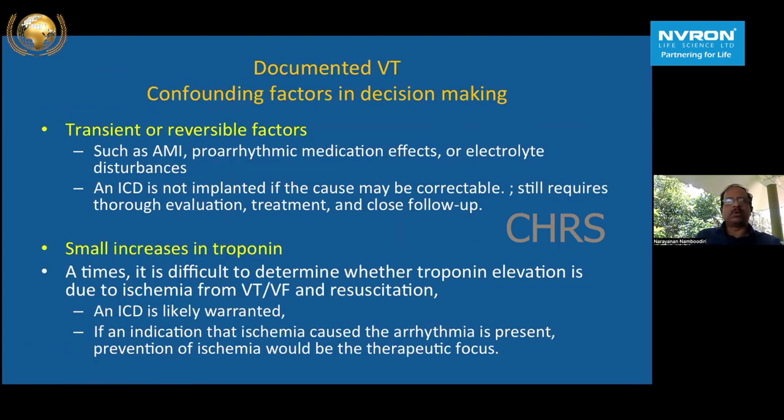this whole subgroup. So when you consider these patients, there are confounding factors, whether transient or reversible factors, like AMI, acute myocardial infarction, proarrhythmic medication, electrolyte disturbances, and ICD is not implanted if the cause was correctable. Still, it requires thorough evaluation, treatment, and close follow-up.